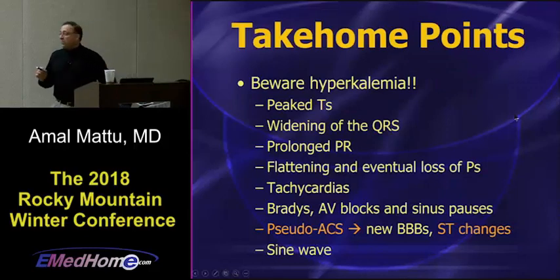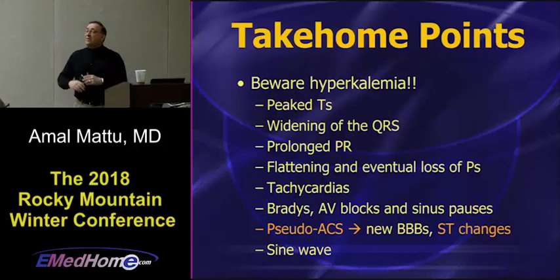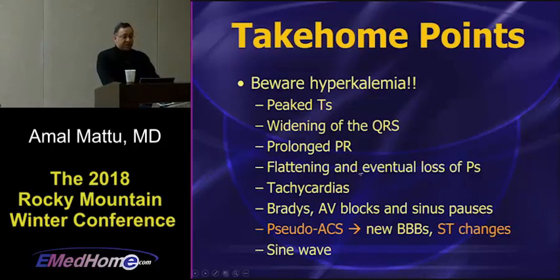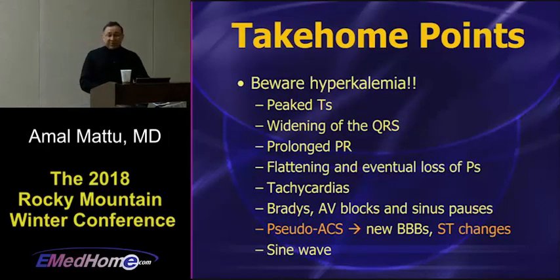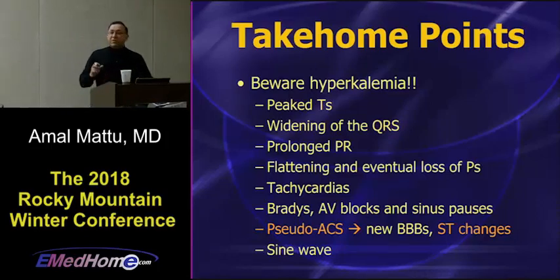So, key take-home points from this second case. Again, beware hyperkalemia. Hyperkalemia does a lot of different things. Everybody's learned about the peaked T waves and the wide QRS. The PR gets prolonged and then goes away, so you can get a wide complex rhythm with no P wave, so it can start to mimic slow VTACH, which is a term I don't like. But whenever you see a wide complex rhythm and the rate's relatively slow, don't call it VTACH.